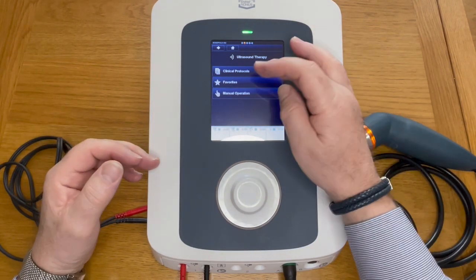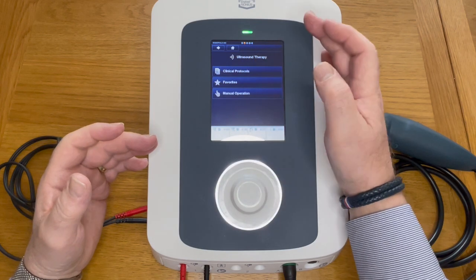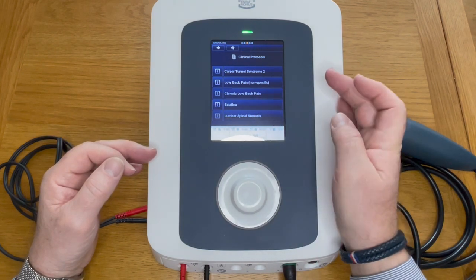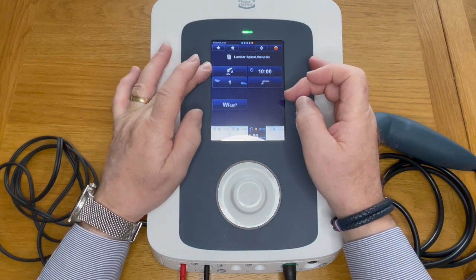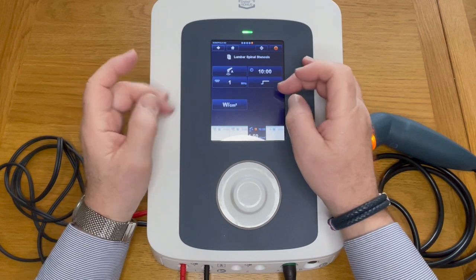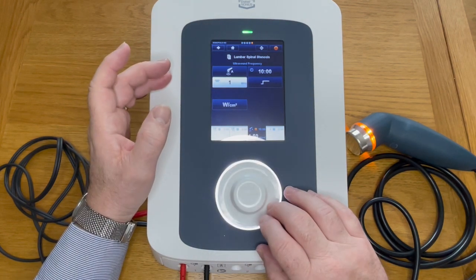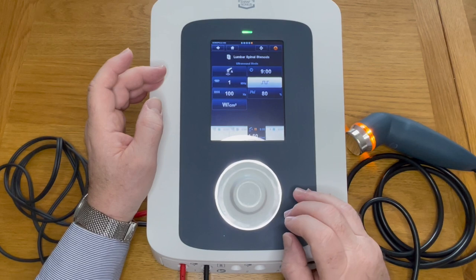In ultrasound, we again have clinical protocols, favorites, and manual operation. Clinical protocols work the same as before — press it and there are five pages. Let's select spine: it's set to 10 minutes, continuous output, one megahertz, channel A, displayed in watts per centimeter. You can press the button to change the frequency — this is a one and three megahertz ultrasound head and you can switch between both. You can also change the time by rotating the dial and switch to pulse mode.